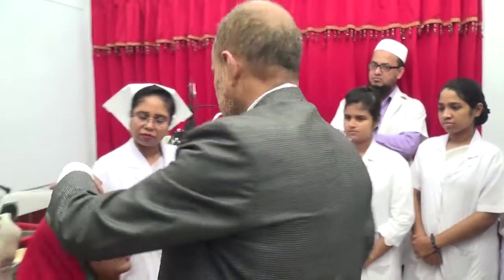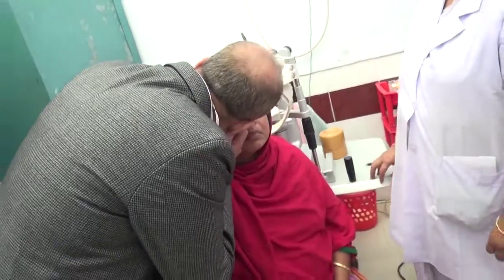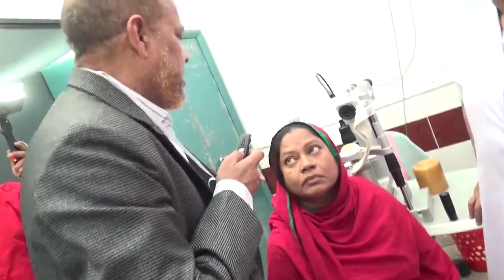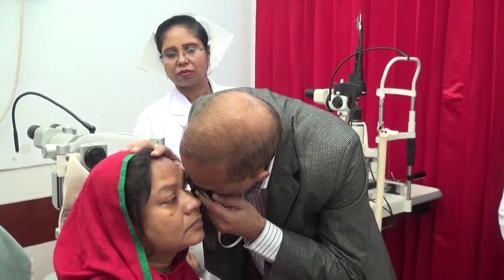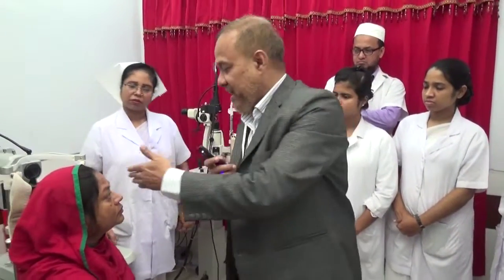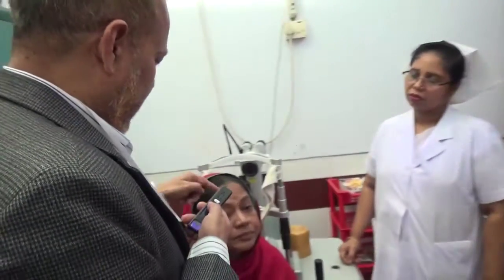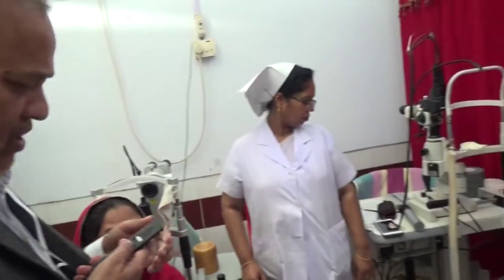I am now seeing the retina on this patient. I can see the retina very well with this ArcLight. For the left eye I have to use my left hand and my left eye, and for the right eye I have to use my right hand — just like with a direct ophthalmoscope.